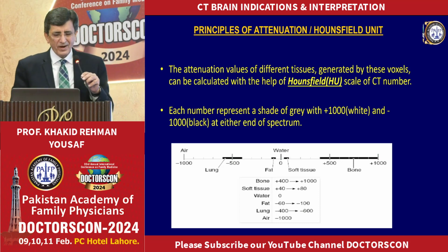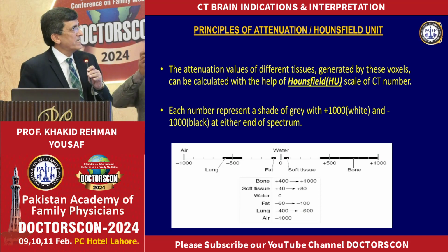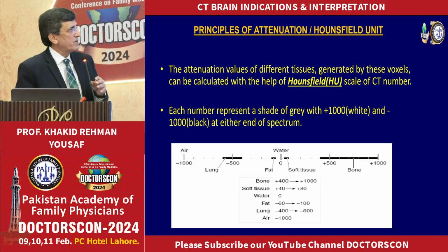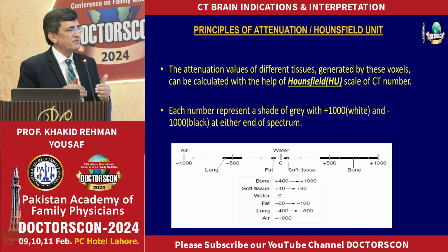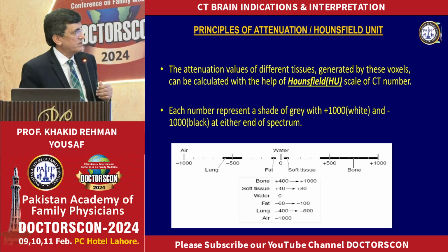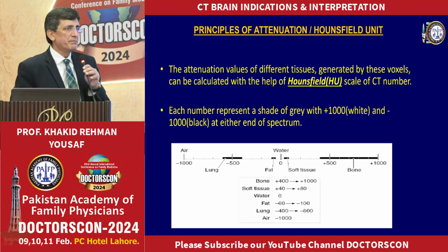A few words about what actually happens when a patient is exposed to X-rays. There is a term used, attenuation. We have read in our physics at FSc level that when radiation is thrown upon certain soft tissue structures, there is variable attenuation according to tissue density, and for that there is this grayscale mapping. This is a bar which maps the absorption power of the tissue, and it is assigned a certain number. The center part is water, which on the scale is 0.